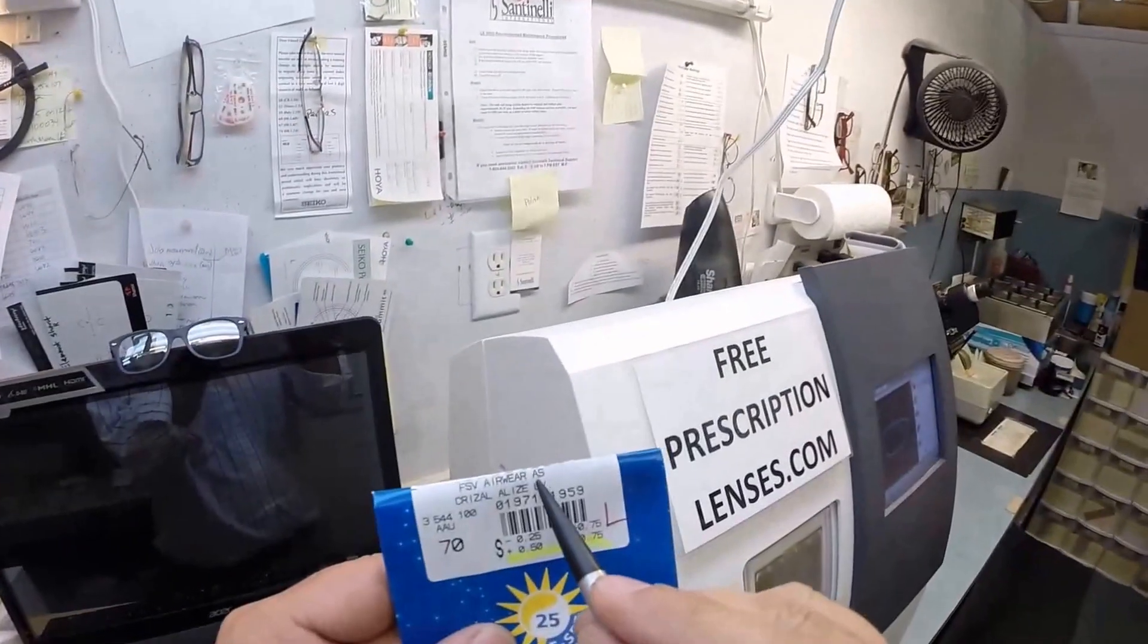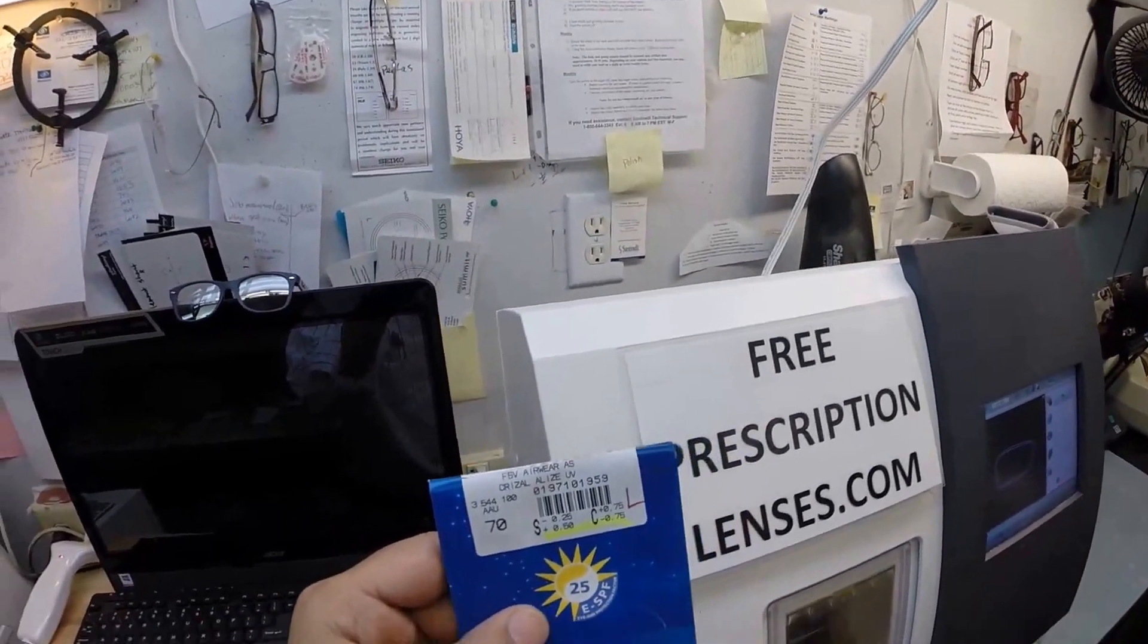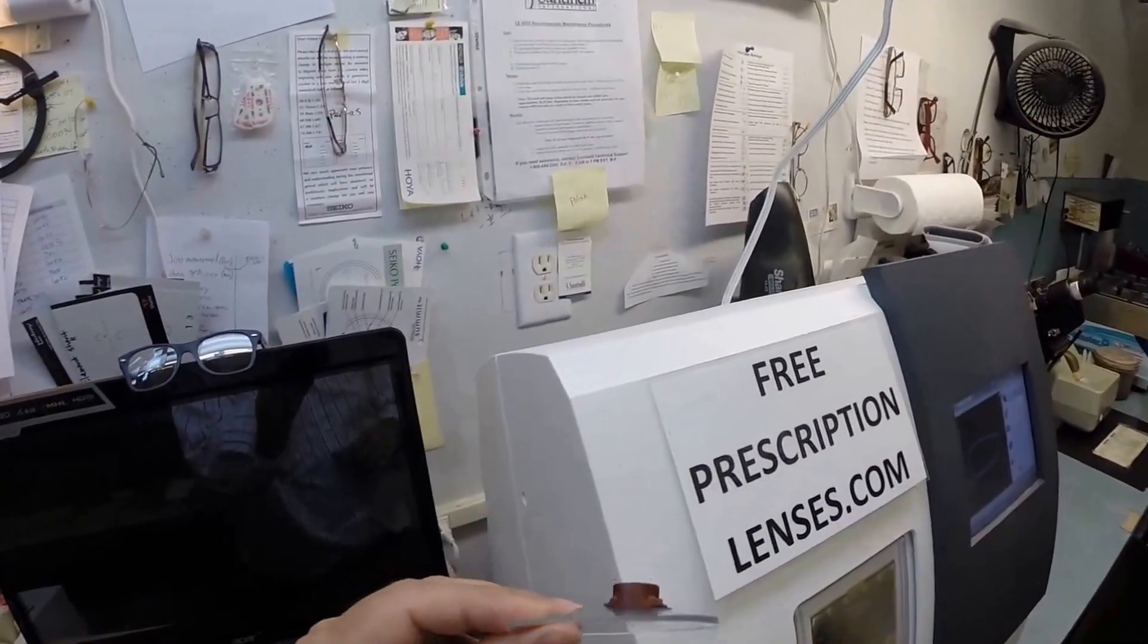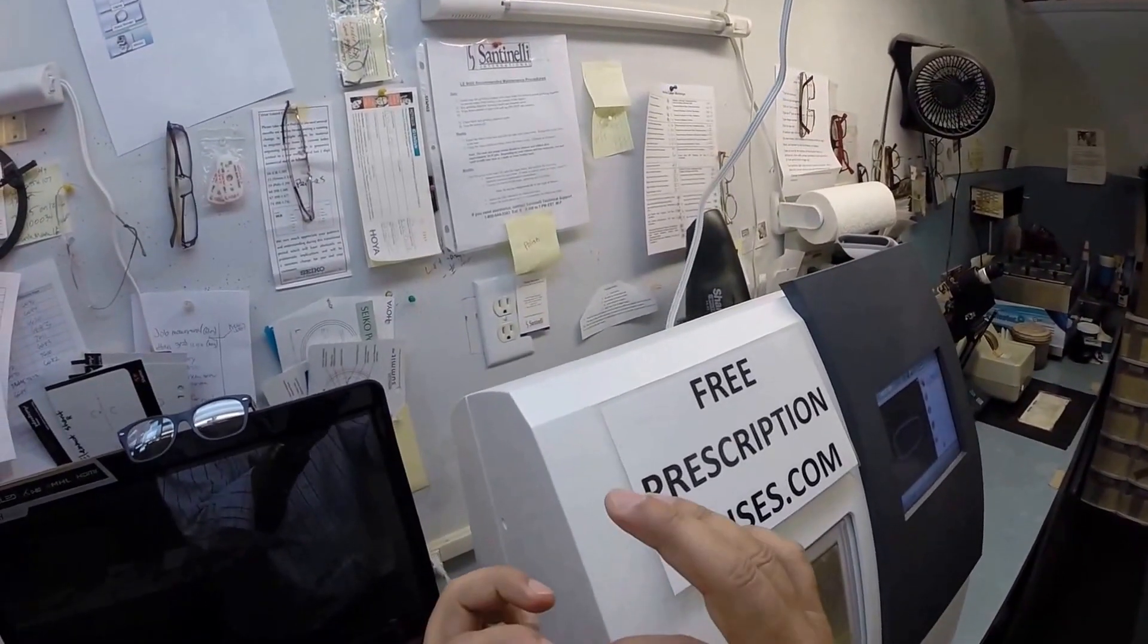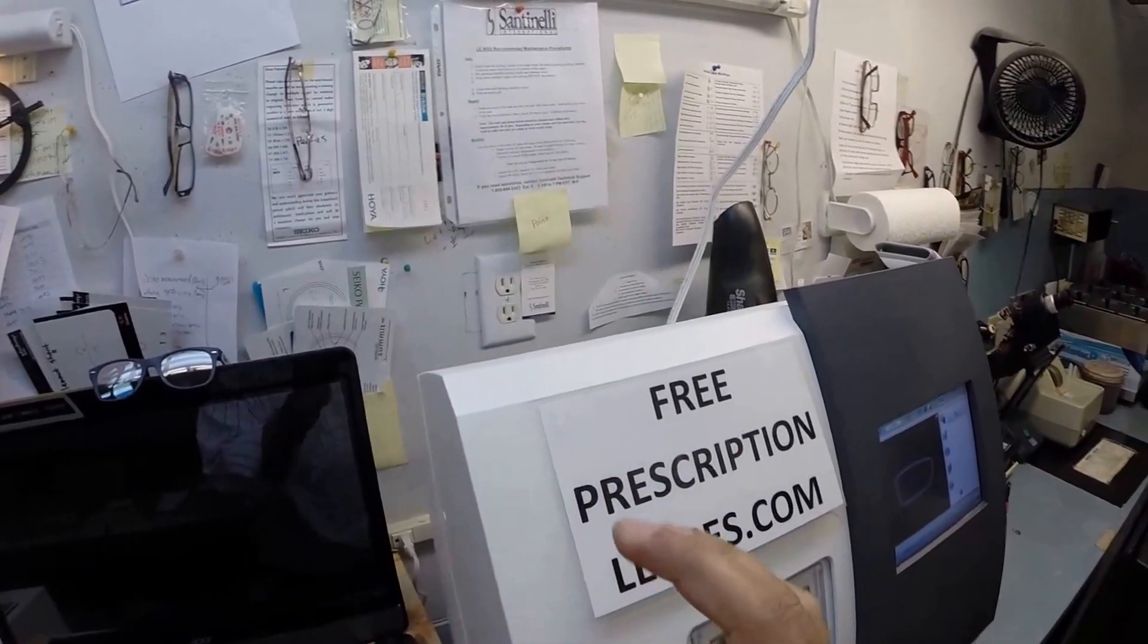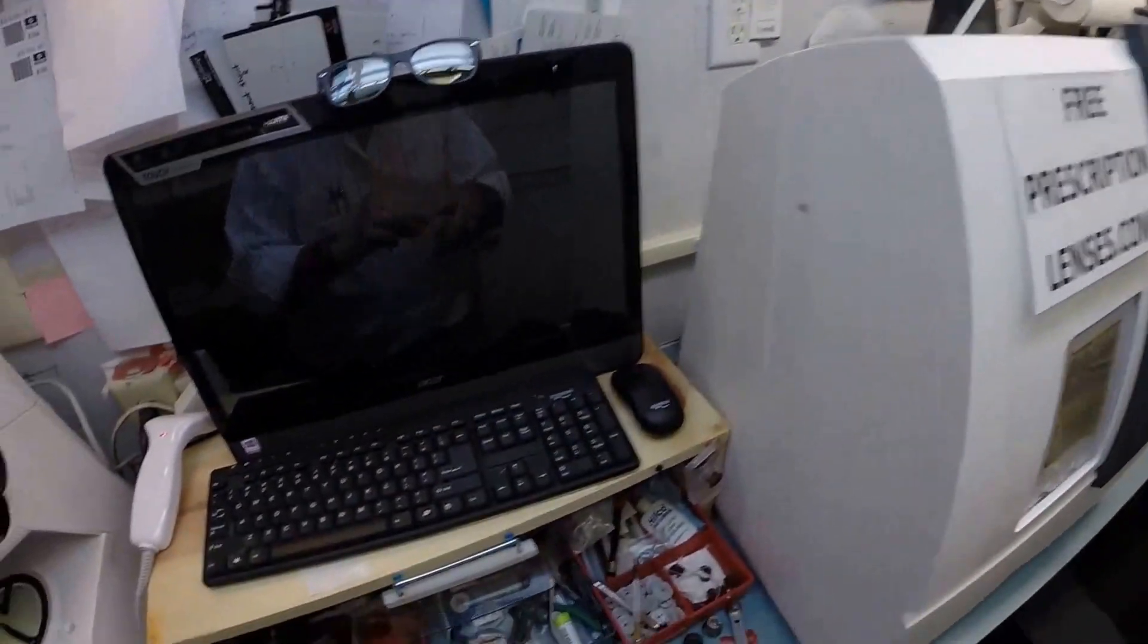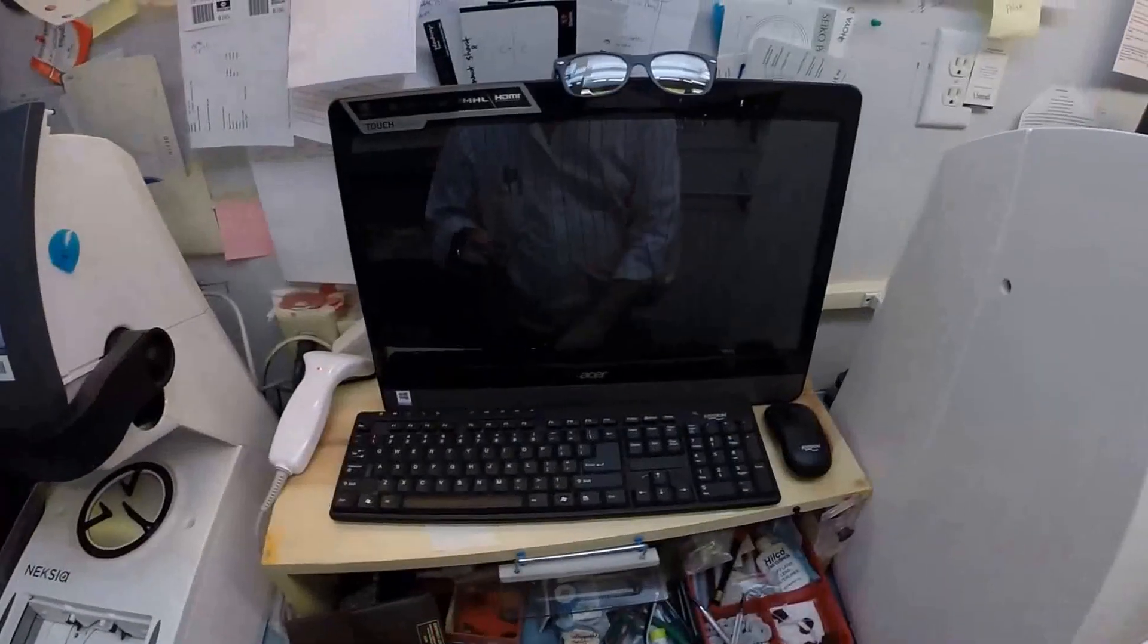We know what the sun's harmful ultraviolet rays can do to your skin from overexposure where your eyes are eight times more sensitive than your skin. So you have permanent sunscreen for your eyes that never needs to be reapplied, unlike lotions, creams and sprays that need to be reapplied every couple hours when you're in intense direct exposure to the sun. Now the other nice thing about your lenses are they are the AS stands for aspheric. Aspherical simply means not spherical. A spherical lens is completely round in every direction, especially for hyperopes such as yourself, which is a plus lens. Your lenses are thicker in the center, thinner at the edges. So not only are they 40 percent thinner and lighter than regular plastic, it has a flatter front curvature to fit today's flatter curvature frames so you can have the best cosmetic fit possible with this.